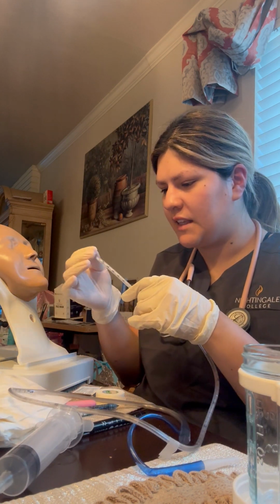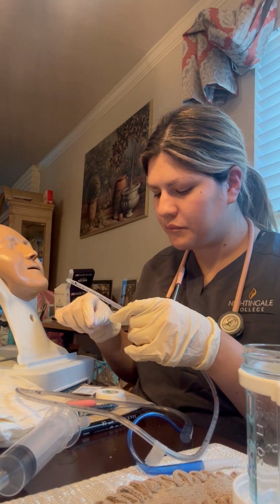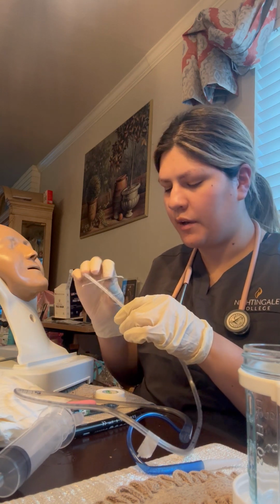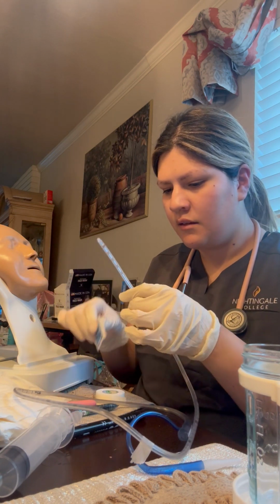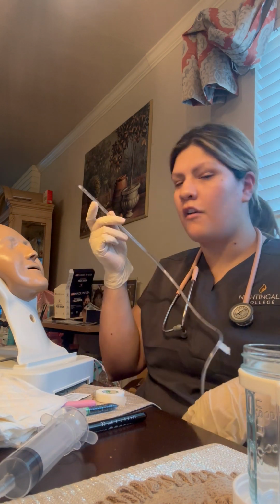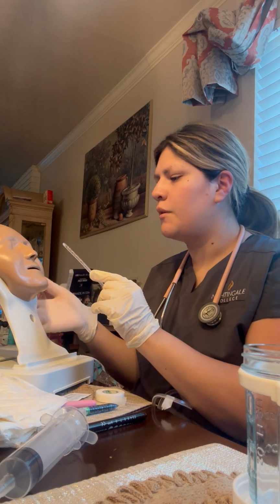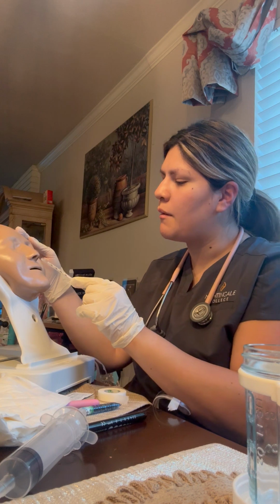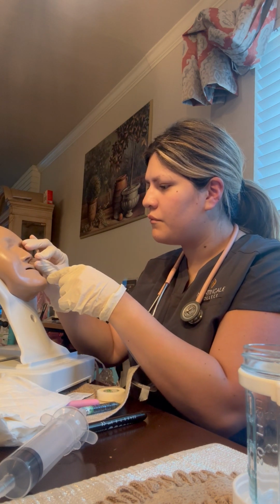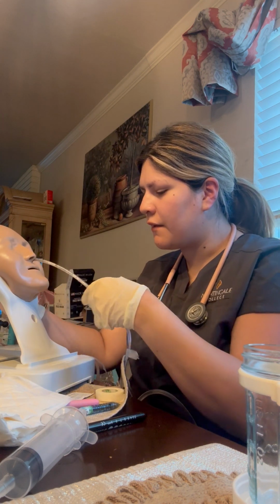Okay, so at this point, I'm going to go ahead and lubricate the tube with jelly. And I'm going to go ahead and insert it following the natural curvature of the tube. So I'm going to have them position their head up, go ahead and bend a little bit back, and I'm going to stick it in. So I'm going to go all the way down to, I said, about 50.